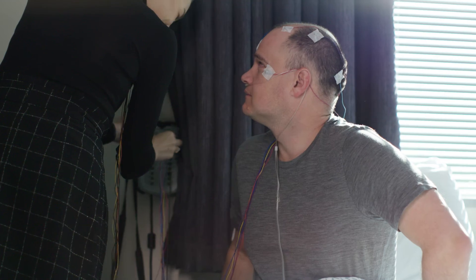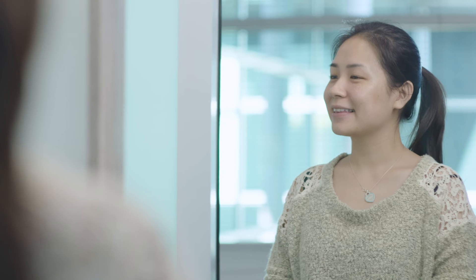Some of the feedback that came through from the clinical validation was that people didn't want to give this mask back. They were like, 'This is far superior to what I've usually slept with.' So I guess that says a lot in terms of the mask itself and what it's actually doing for them and the quality of sleep that they're getting.